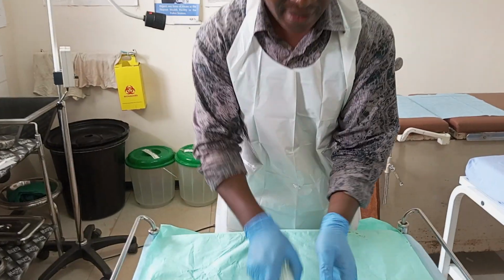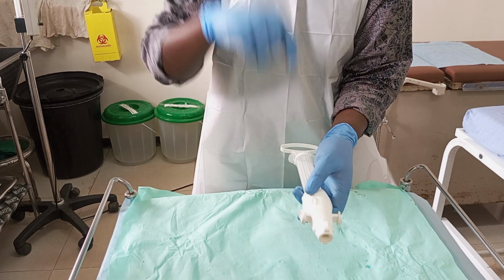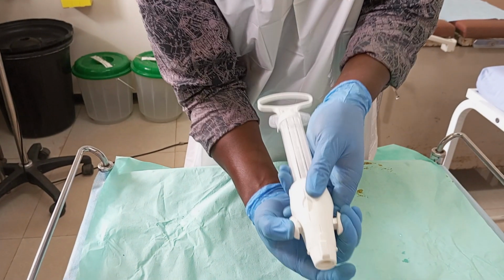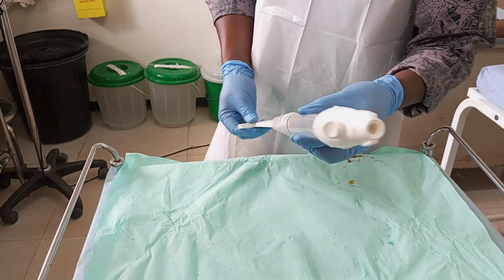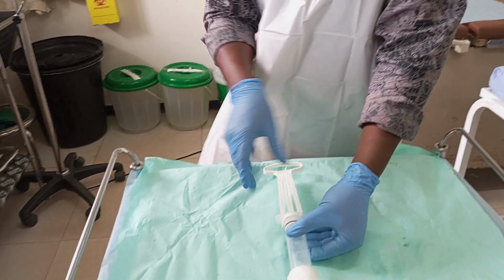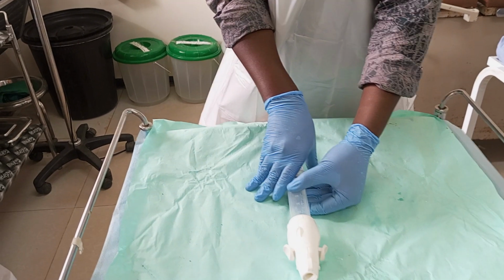Once you have assembled like this, don't forget also to do a quick test to see if it is able to maintain a vacuum. Go in, push forward, aspirate. What you've just done is referred to as charging. We have just charged the gadget in readiness for use in the patient.